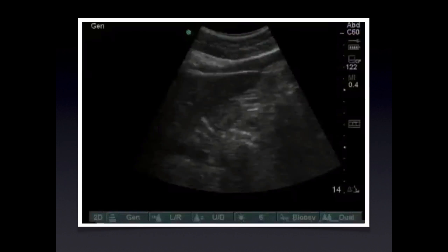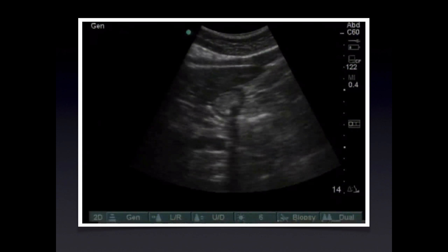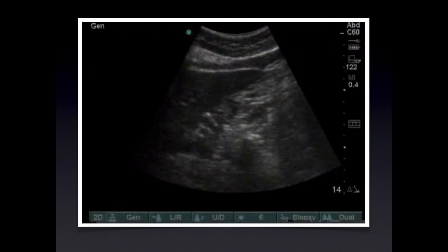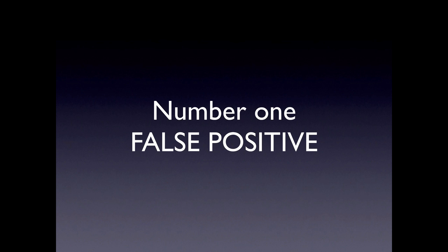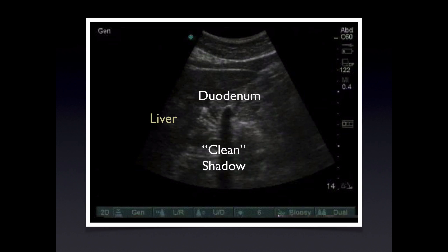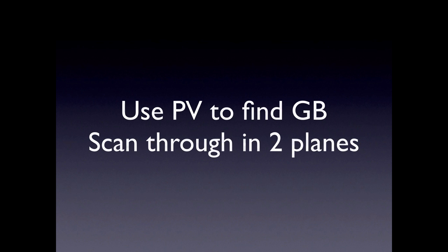Case 6 — a classic case. The diagnosis is gas in the duodenum — the number one false positive in experience. Reviewing the anatomy: we see the liver and a duodenum with a relatively clean shadow that does appear similar to the type of shadow a stone would cast, as opposed to the dirty shadow typically expected with air artifact. However, higher density material in the duodenum can look just like this. To avoid this pitfall: use the portal vein to find the gallbladder and scan through it in both planes.